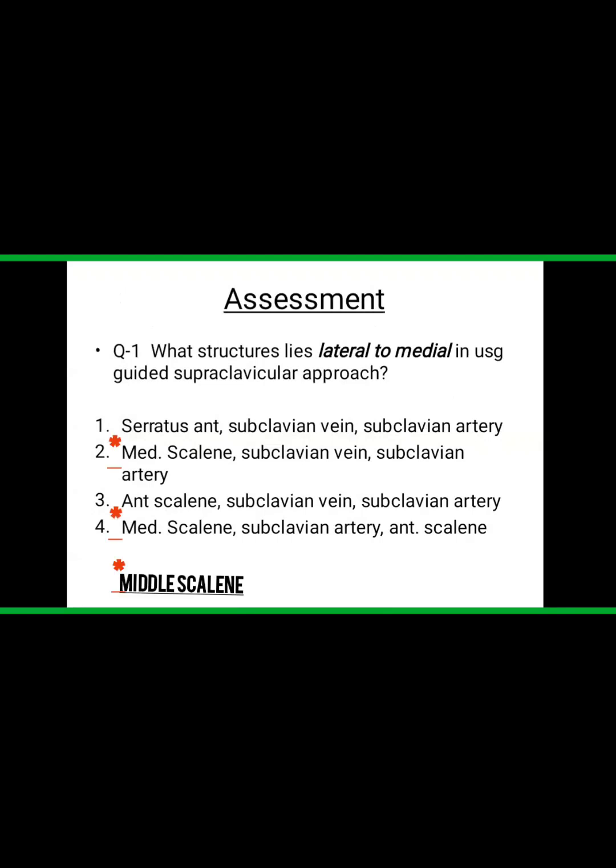Okay, this was all about the theoretical part. We are heading towards the live demonstration in a while, but before we go there is an assessment. What structures lie lateral to medial in the ultrasound-guided supraclavicular approach? Note down these questions, we'll be discussing them.